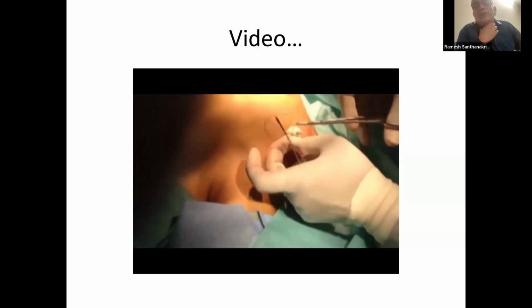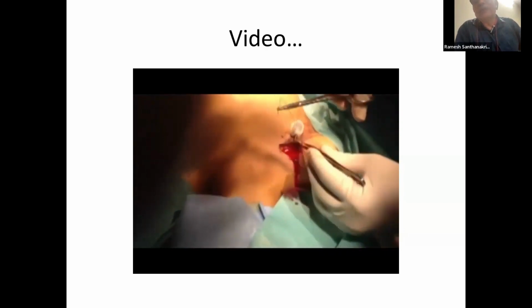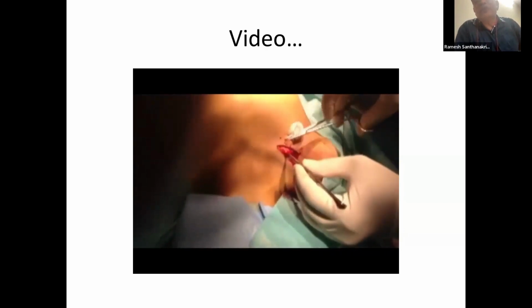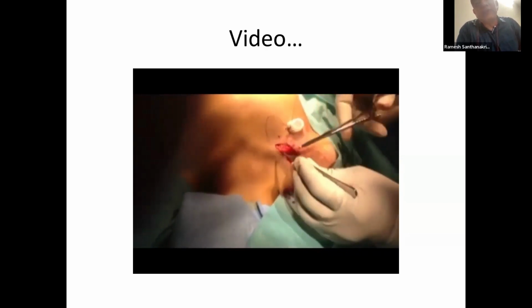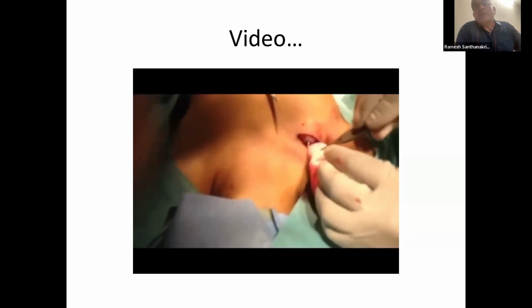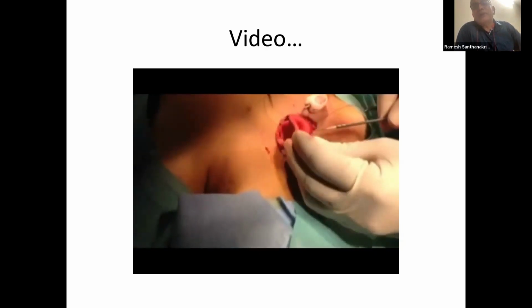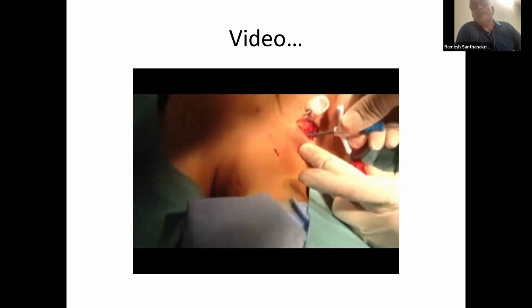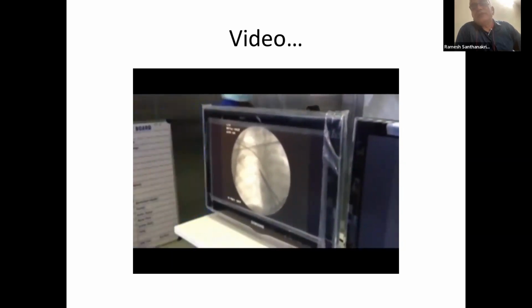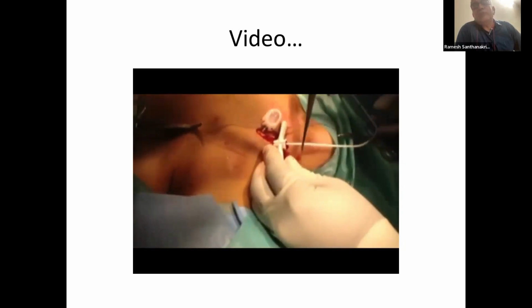This is just to show the position of the port. We are measuring it. We are putting a port and a catheter. We are placing a few stitches on the port to make sure that it is adequately and cleanly fixed. This is essential to make sure that the port doesn't displace. If you can make out, it is fairly well placed, and now the catheter is being connected. We make sure that there's going to be no kink. The catheter is being tunneled from the site of incision to the site of the incision for the port. At the end of it all, we again confirm the position by means of a C-arm.